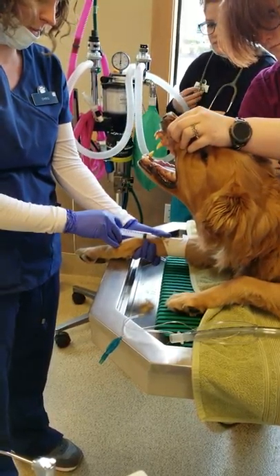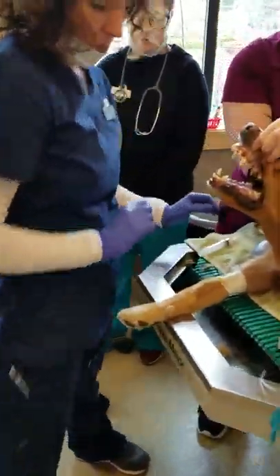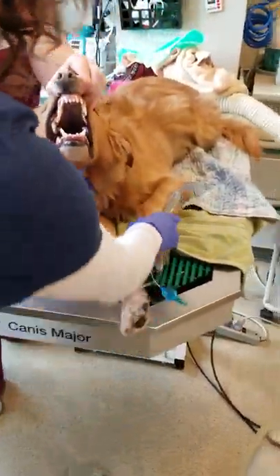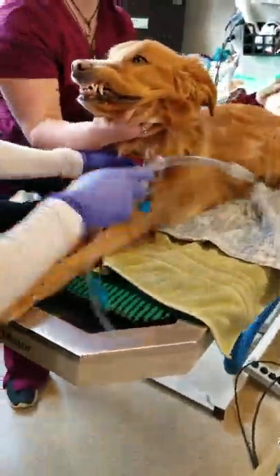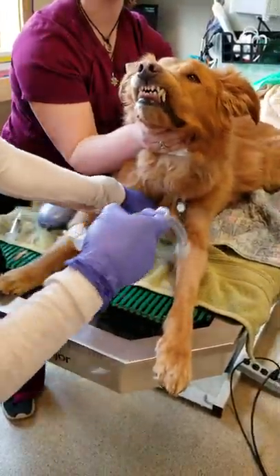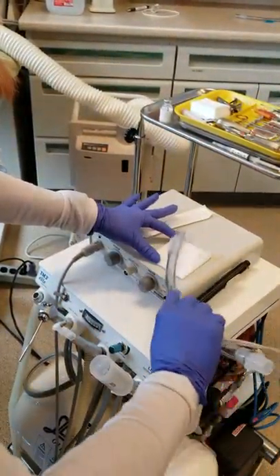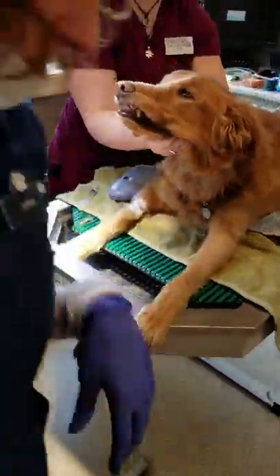Okay, let's try that. Let's go ahead and double check our measurements. That's going to be perfect. Got my sterile lube right here. Lubricate. Use a laryngoscope. Yep.